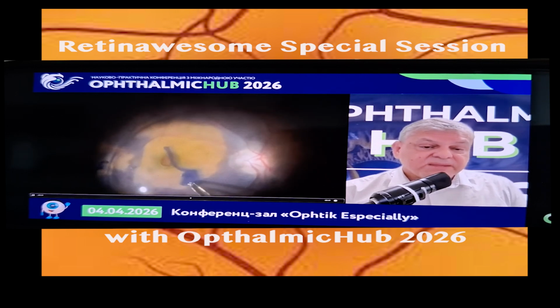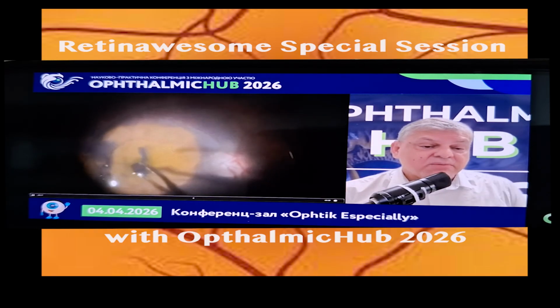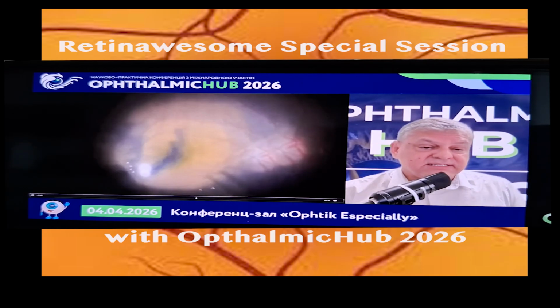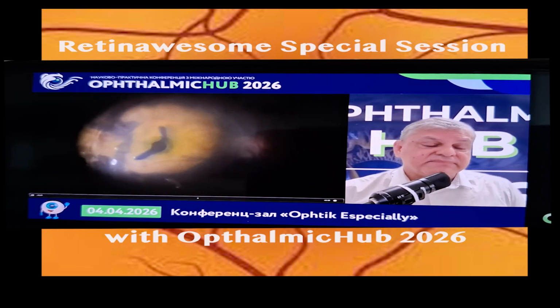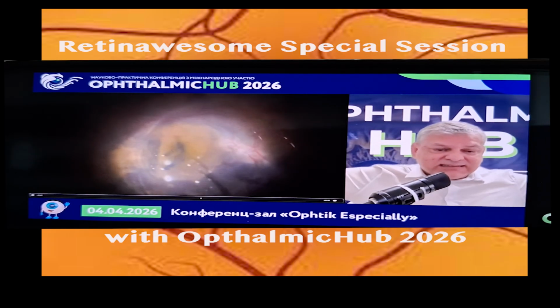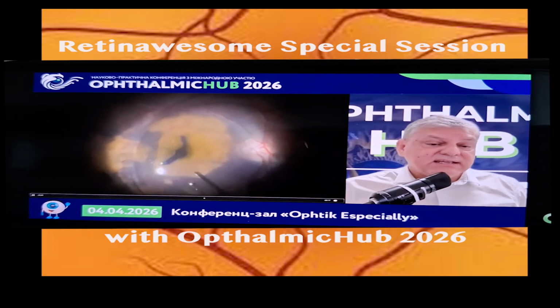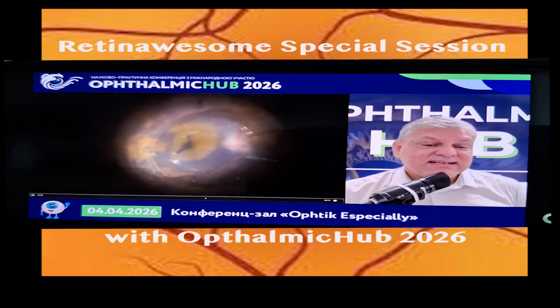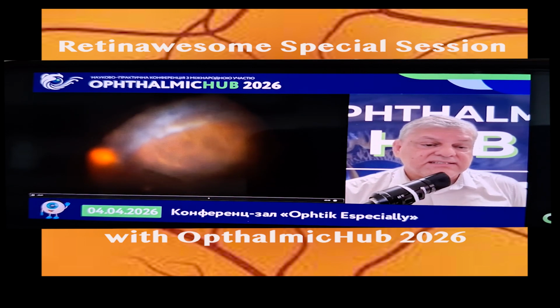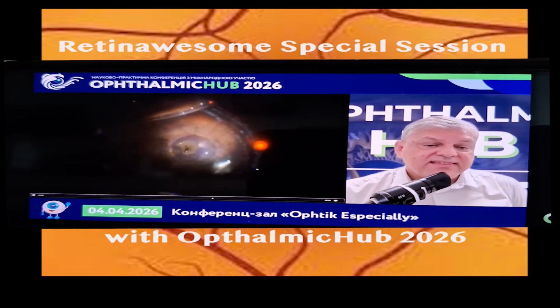And I'm approaching the ILM, as you see here, towards the macular hole, and the central part of the internal limiting membrane is there, and you have two arms that come out of this central part. The purpose of these two arms, two stalks of the internal limiting membrane, is that they keep the retina stable, and after they heal, they're going to contract and help close the hole.